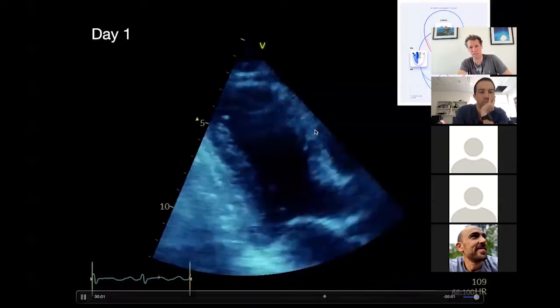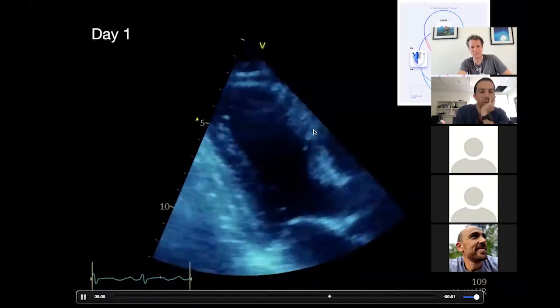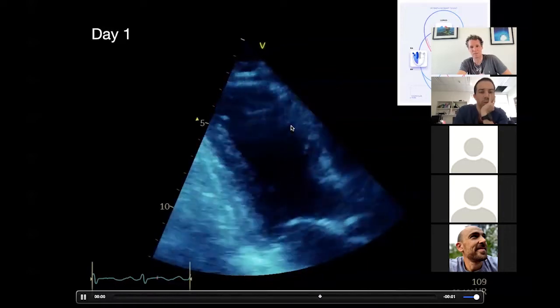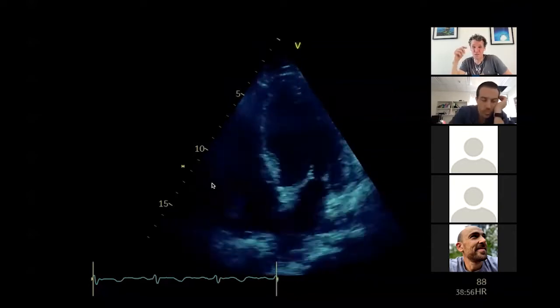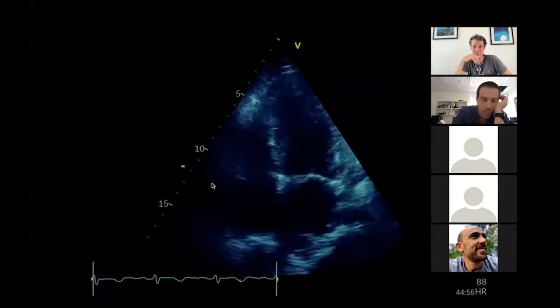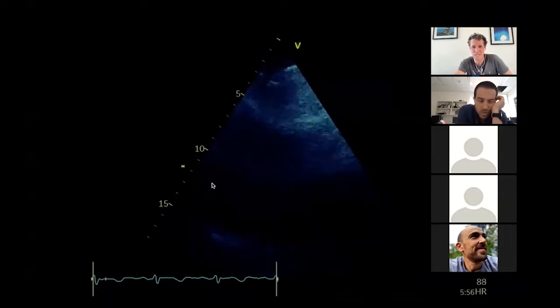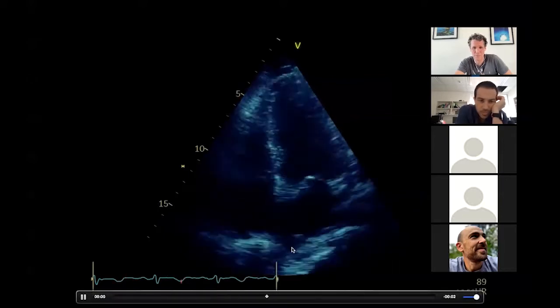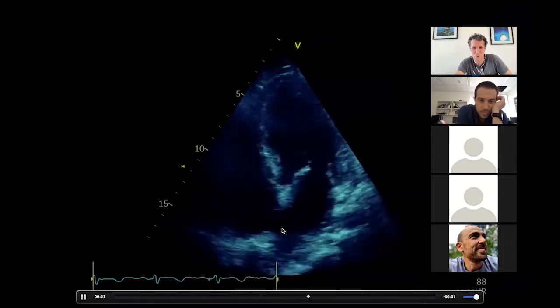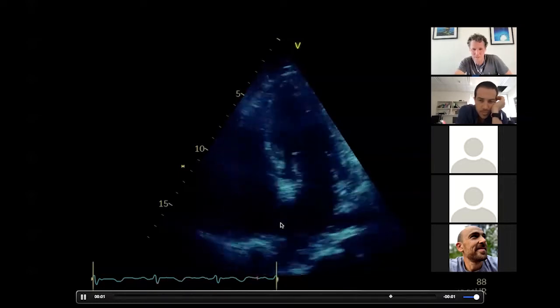And the walls, as already been told by Lewis, are the anterolateral, the anteroseptal and the inferolateral. Apical 4-chamber views are sometimes not the best, but we can see it backs up our view that we've got normal LV function. The RV does not look dilated in this, so it doesn't look greater than 60% the size of the LV. Left atrial pressure has the appearance of maybe being normal. I think the interatrial septum is not pushed one way or another, but obviously the views are not great.